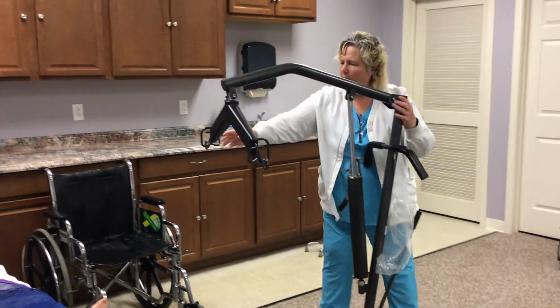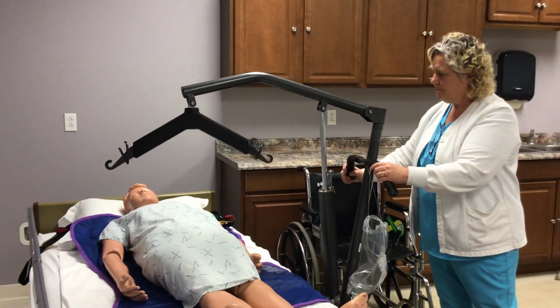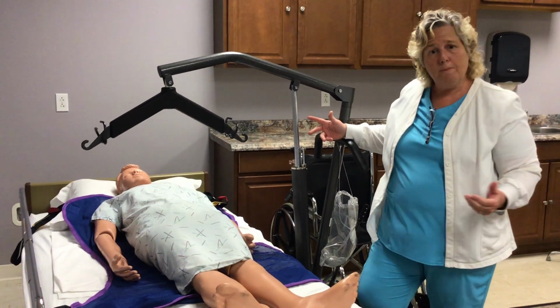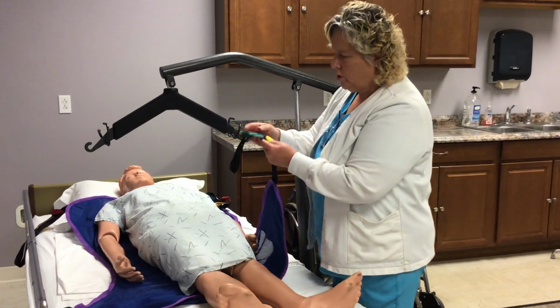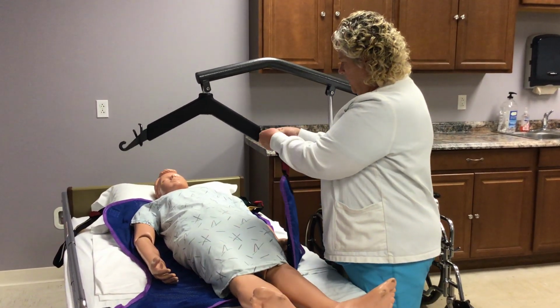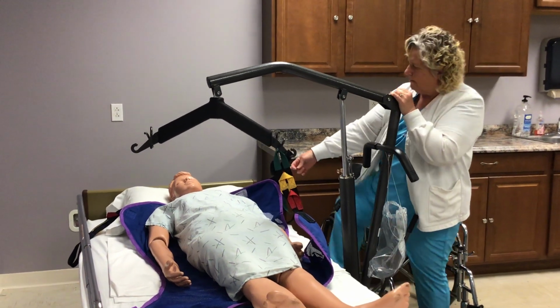So you lower this. I like to go ahead and get the arm turned and underneath them. And then based on the person's size and what you're going to do with them, you may be transferring them to another bed, you may be transferring them to a wheelchair, is the type or the color that you would use, and that would be in their plan of care. So today I'm going to use the green at the bottom, and I'm going to use the red at the top.